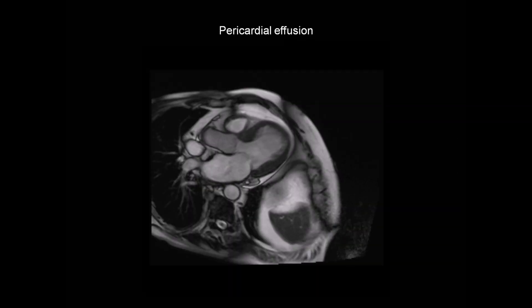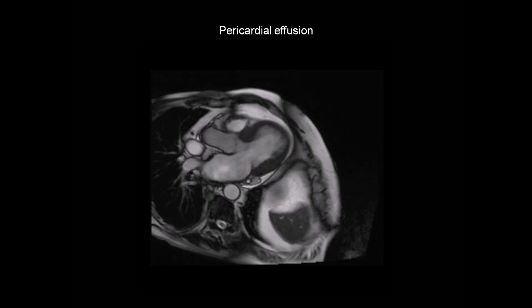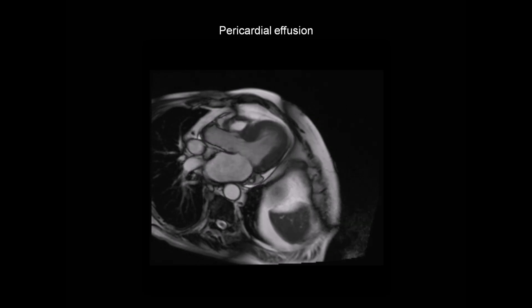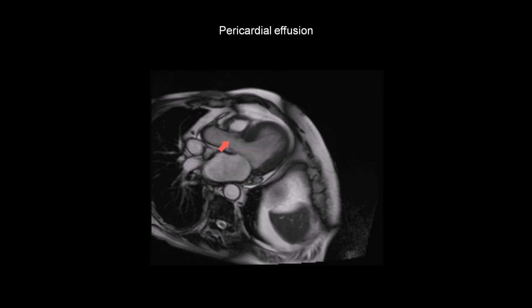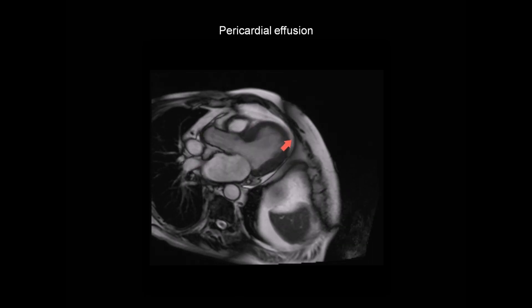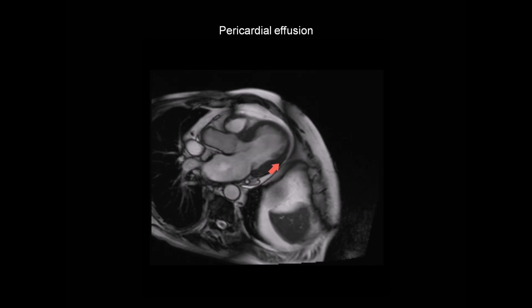Another feature seen in cardiac amyloidosis is the presence of a pericardial or sometimes a pleural effusion. This is a cine CMR three-chamber view showing the left ventricle, left atrium, aortic valve, and aortic root. And we can see evidence of a relatively small pericardial effusion present.